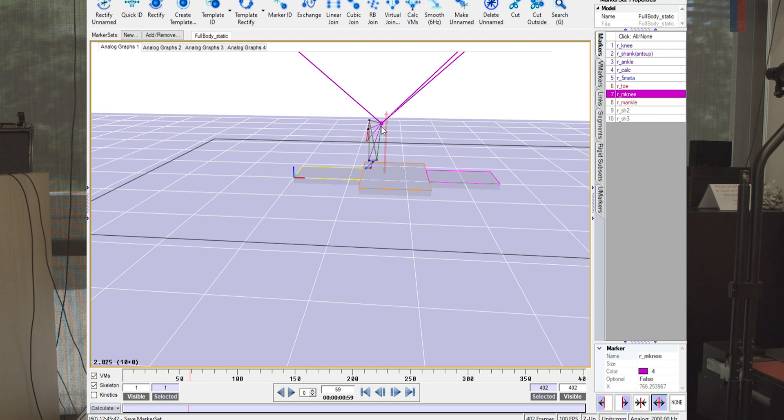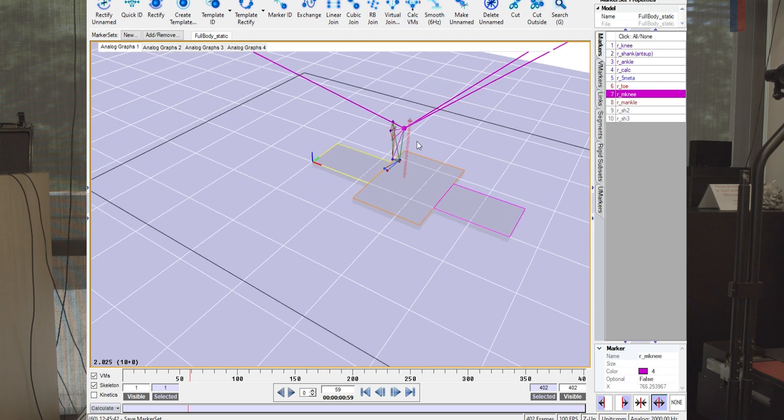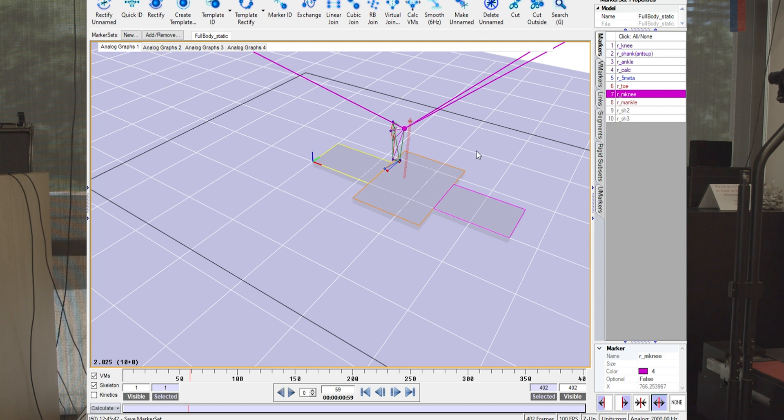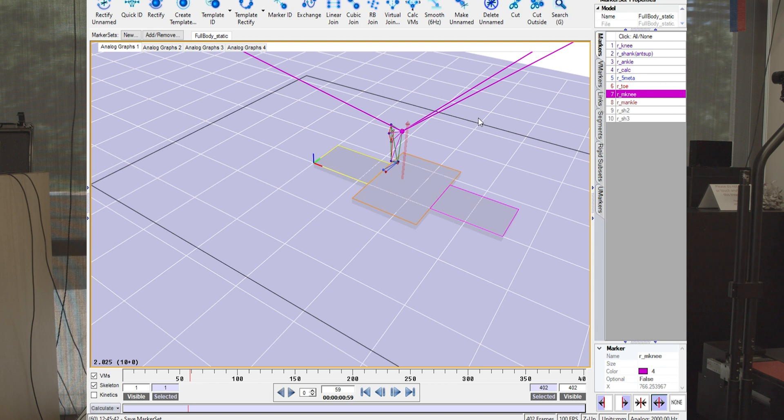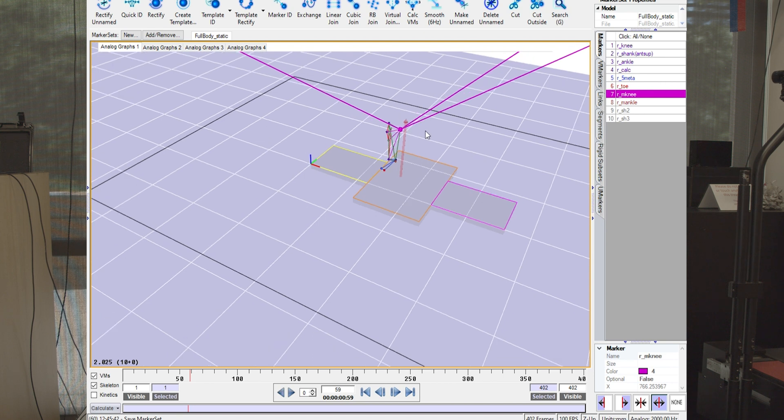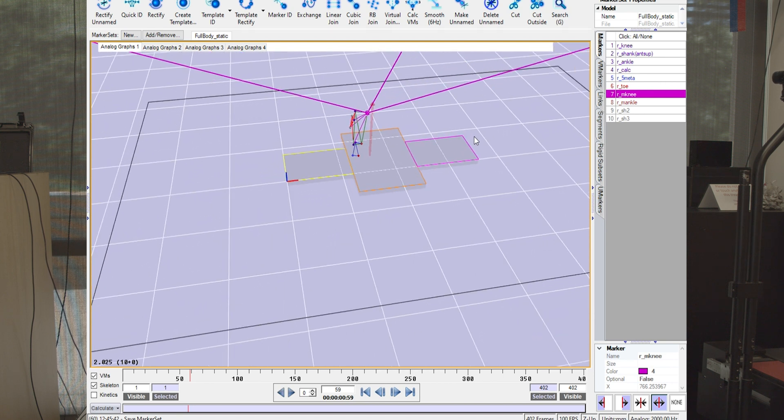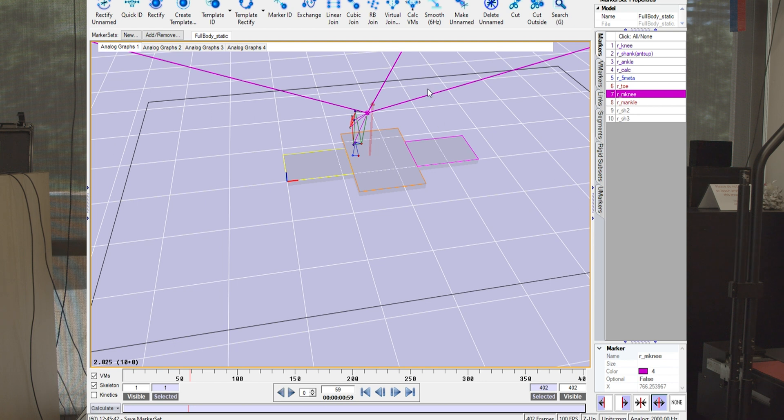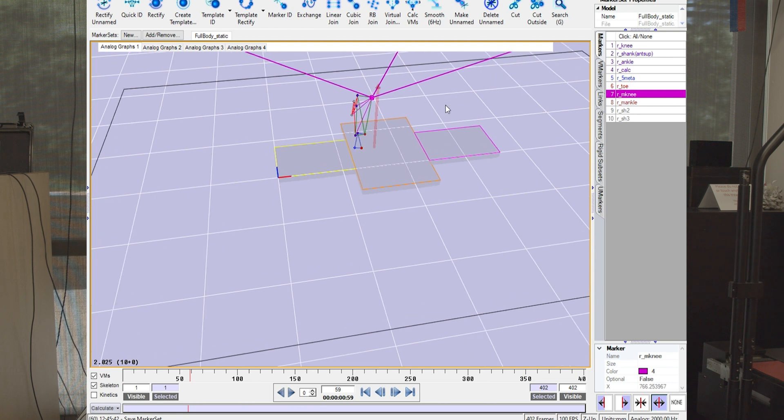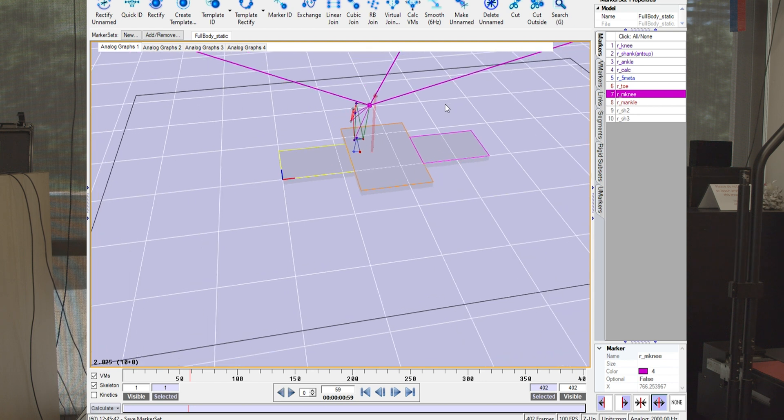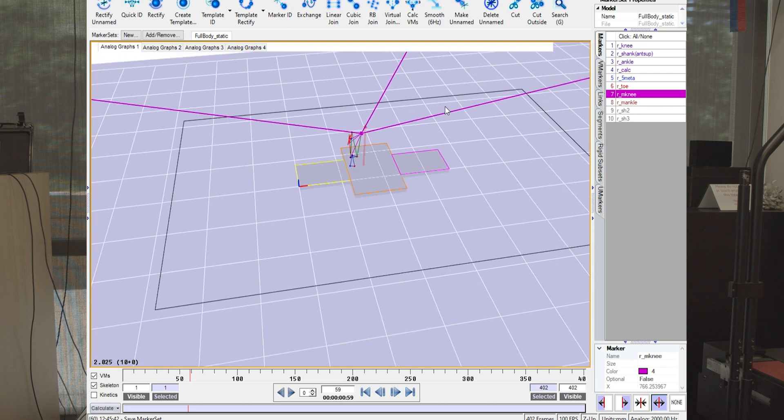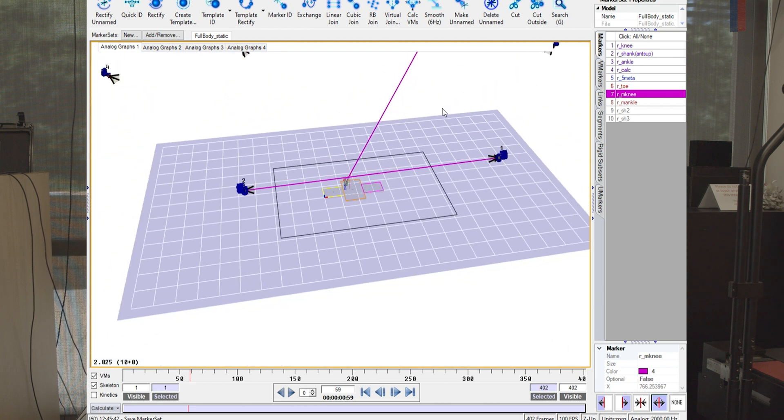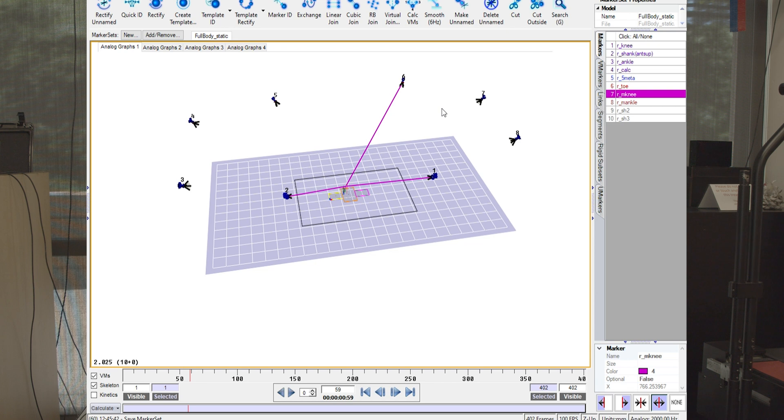Here's the medial knee marker. If we look at just the medial knee marker, which you remember earlier we talked about how we actually end up removing that anatomical marker because it's often obstructed from view for the cameras and can often be hit by the other leg during motion. You can see right now these three rays means it's being seen by these three cameras.